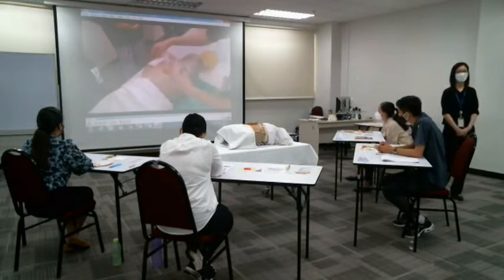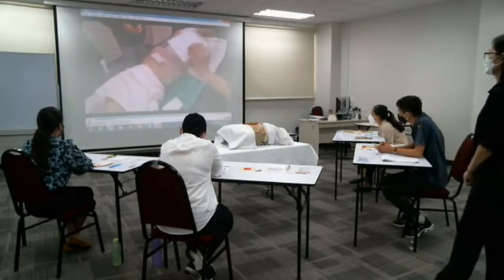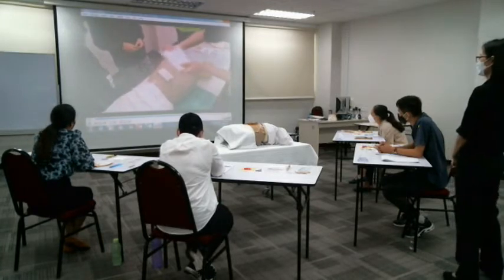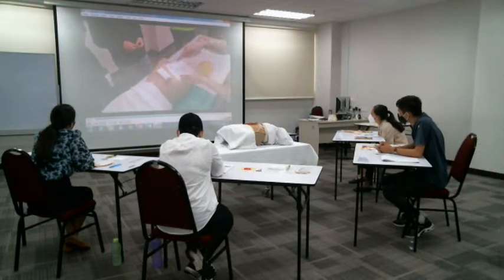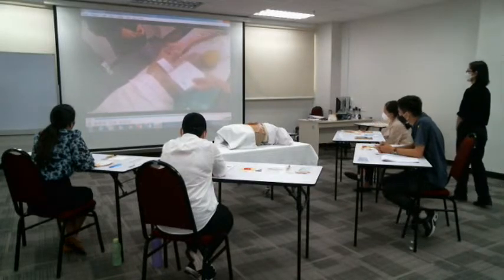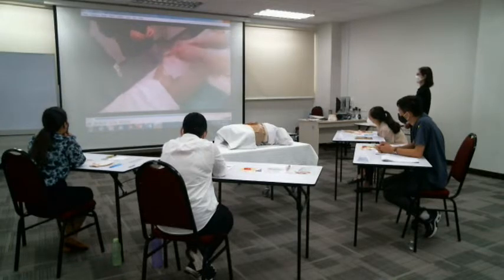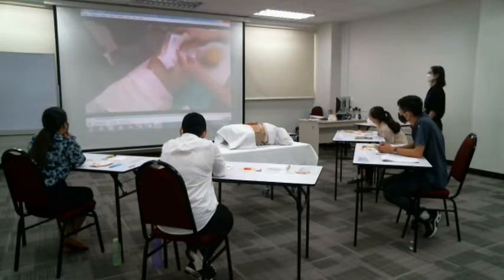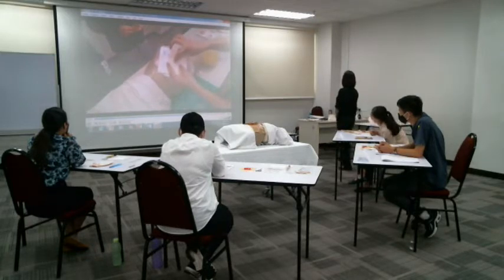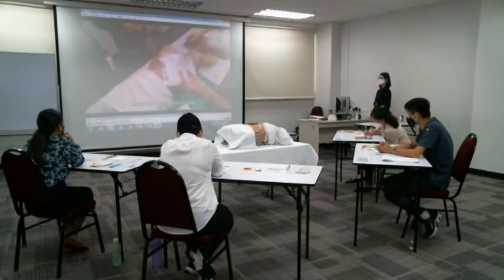Okay, alright. So now I have my new bag. This is front, this is back. Because I take it this way, I'm going to do it this way. If the shape is not exactly round, you can fit it out. Okay, take it this way. Then you already get the cut from this tracing paper, so you make the hole in the center. Now you are drawing on the patient's colostomy bag.